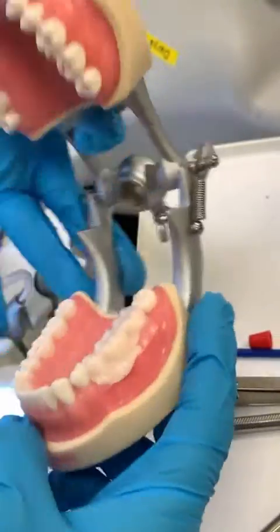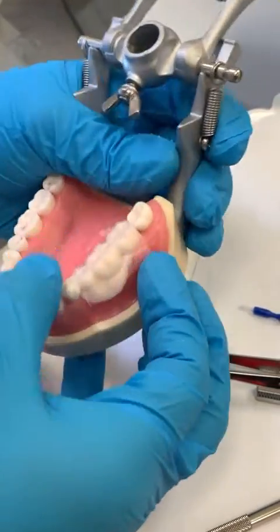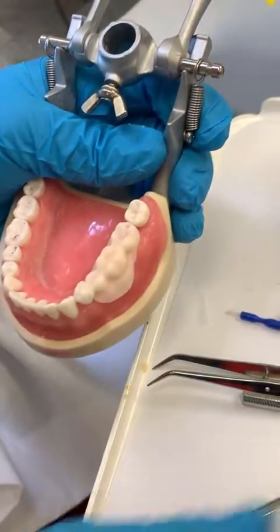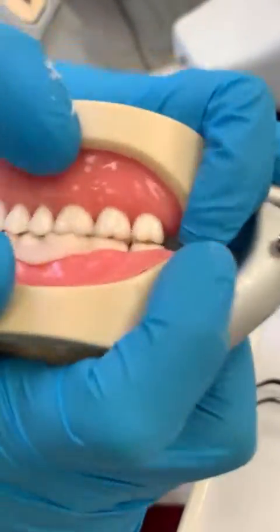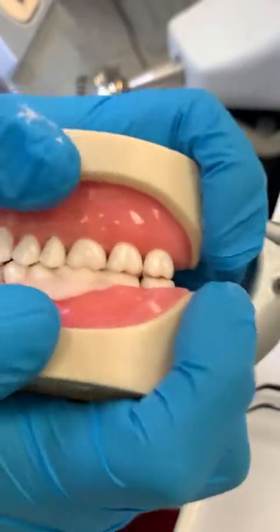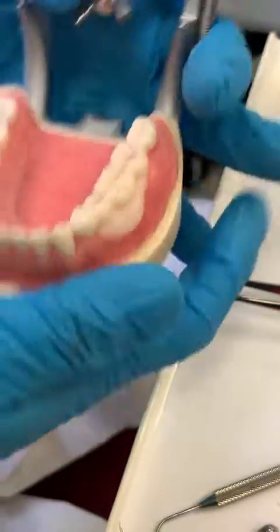So when you have it there I'm going to press down, then I'm going to remove it and have them bite down. Because we want the occlusion to be registered in there. It's messy but it should be fine.